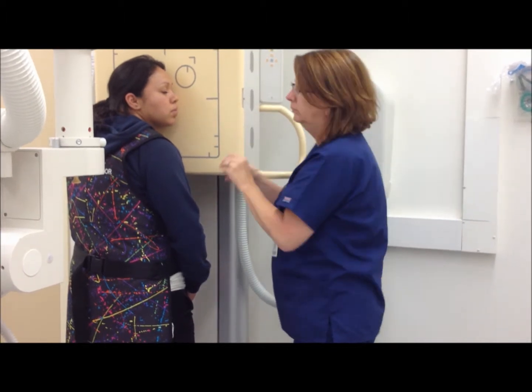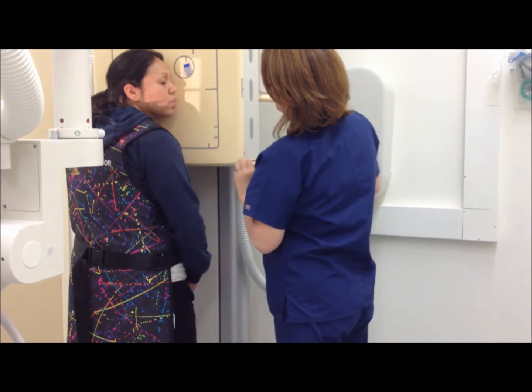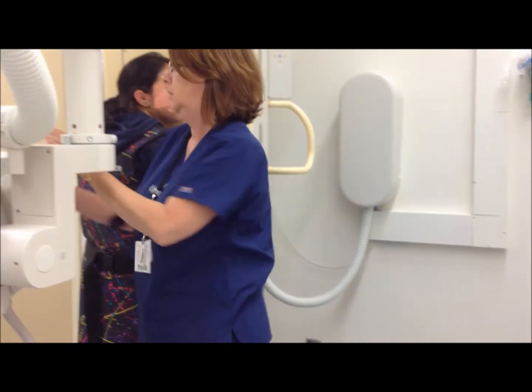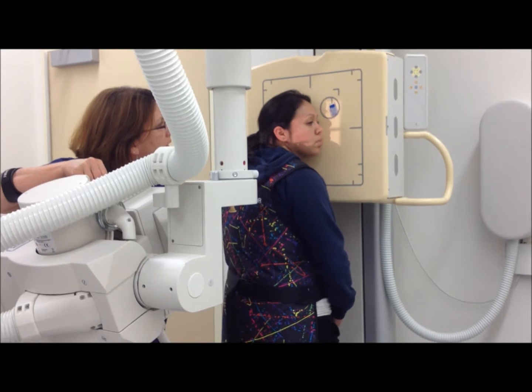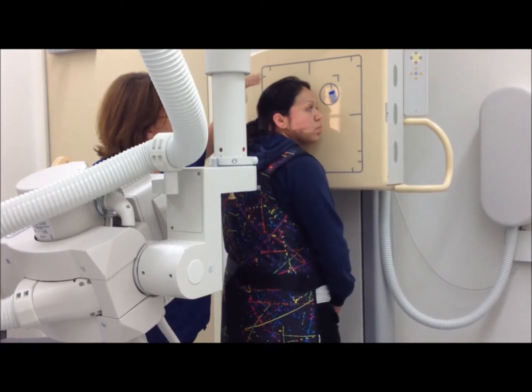My marker will go in the light. You want to collimate in some, so I'll put my marker in the light field outside the patient's shadow.